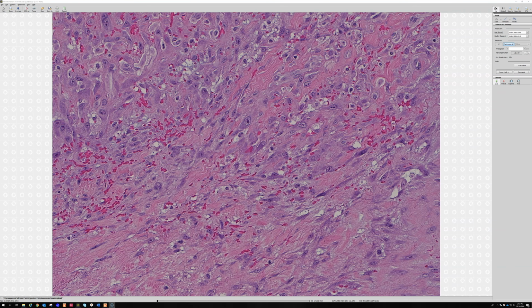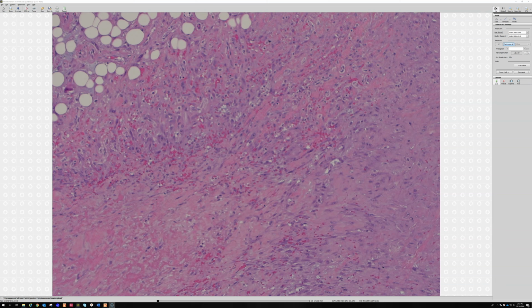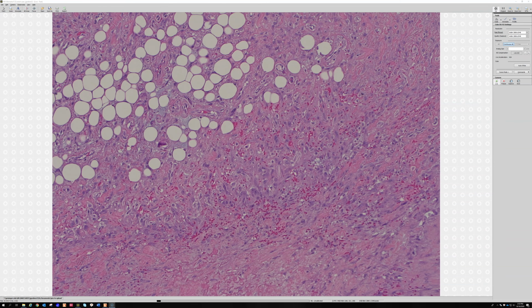So again, this is a good reason whenever you have a biopsy site or something that's really revved up and you know that it's benign and reactive granulation tissue, study that and get used to it. Study it closely, and you'll get used to just how weird myofibroblasts and vessels can look when they're reactive. Because otherwise it's really scary.